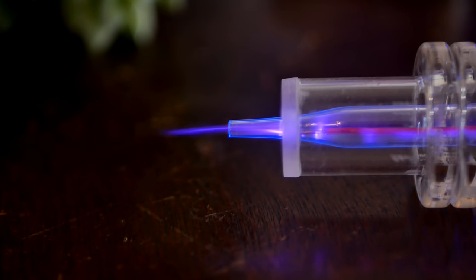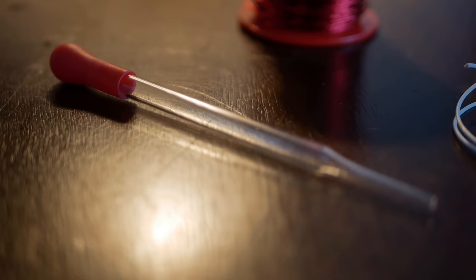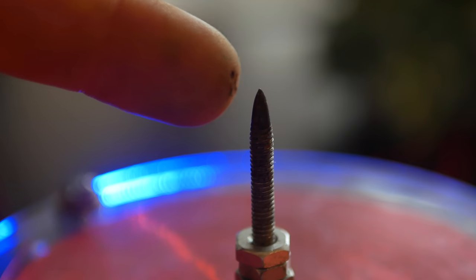Cold plasma requires only a few things. A high-voltage, high-frequency power source. I use my pancake slayer, because it's pretty. Glass pipette. Wire. Some rubber tubing. Extra skin to replace what you'll definitely burn off. And a supply of helium gas, which you can get for about 35 bucks at a party store.